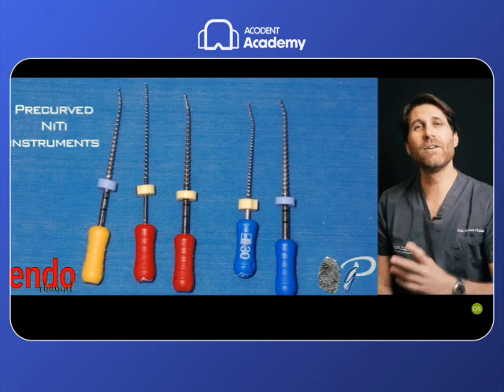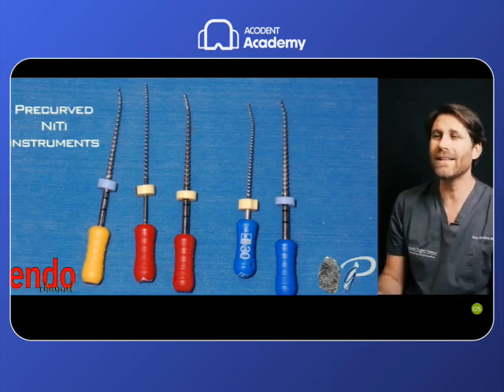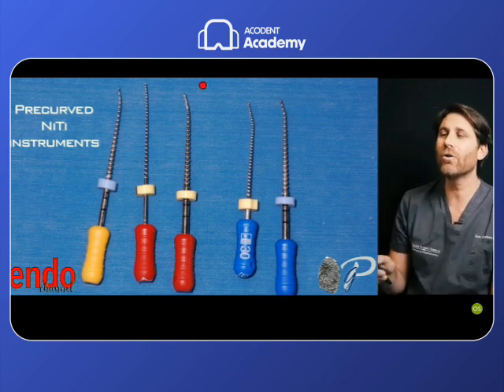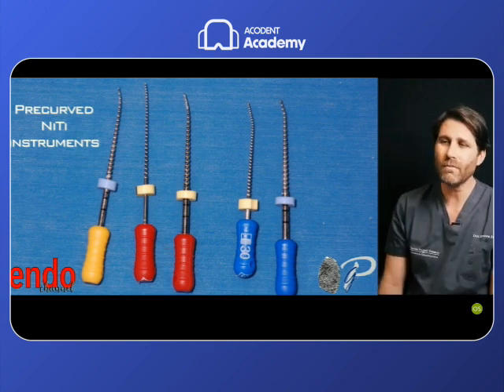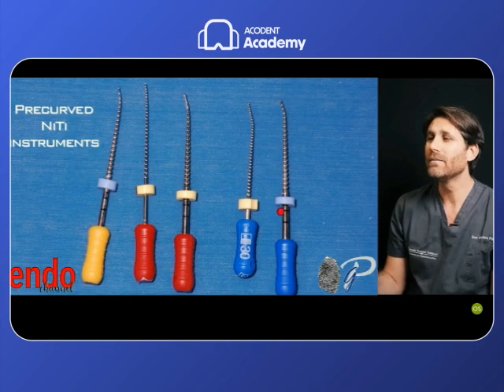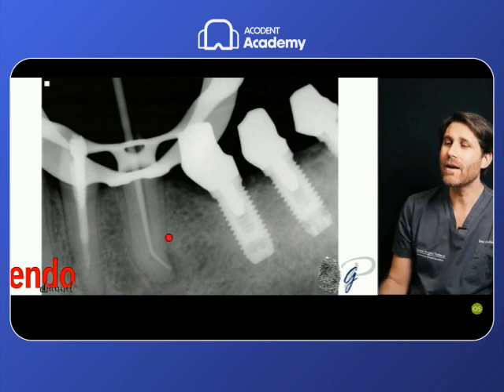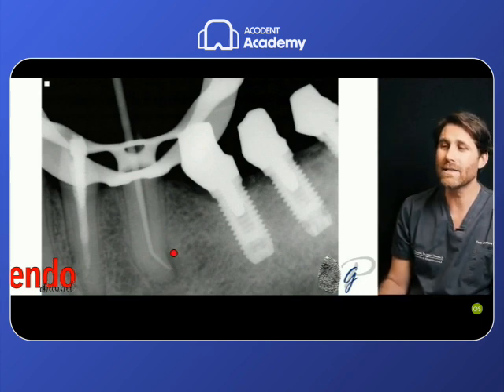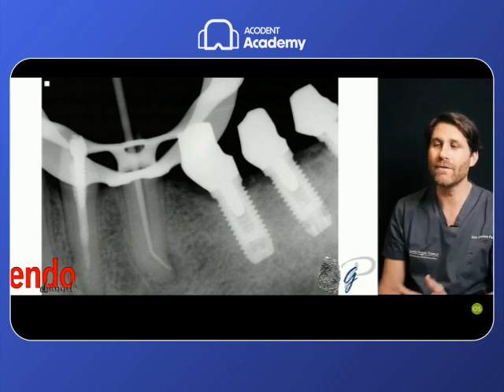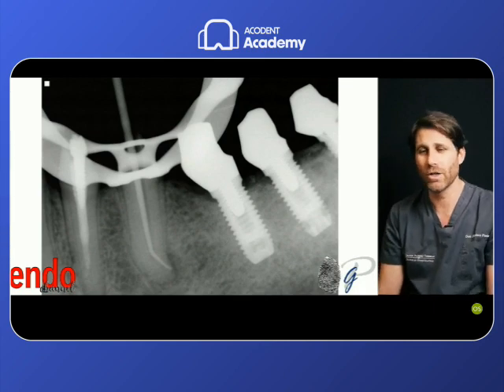Those are size verifiers by Thermafil or Gutta-Fusion or Gutta-Core that can be precurved. They are in nickel titanium, taper .04, between .04 and .05. So I alternate the .02 tapered and the higher taper to make the preparation of the apical third of the root canal to sizes compatible with the anatomy to promote the healing. So I need to go more than 25, even 30, and I need this nickel titanium with these sizes to avoid transportation of the foramen.